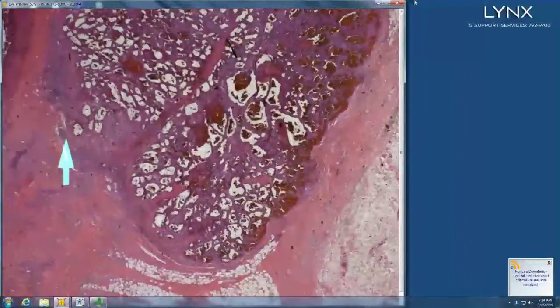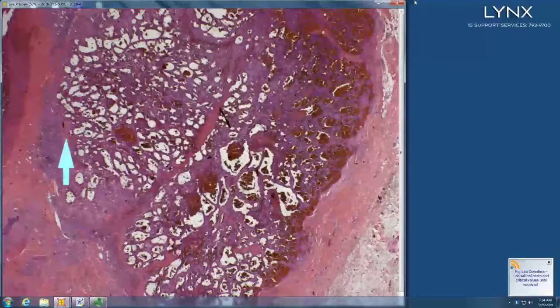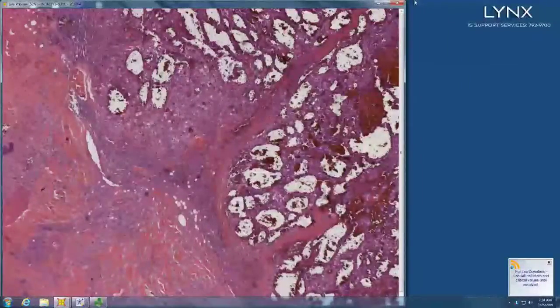Collection of blood vessels. It's like someone might be thrombosed. Yep. It's like there's almost like a separation, kind of PG-like, but it's deeper. Yeah, it looks kind of PG-like, all those blood vessels. Now, how about at the side here?